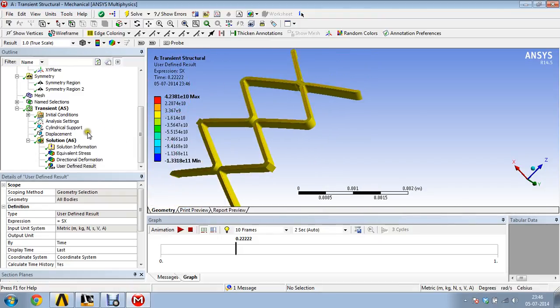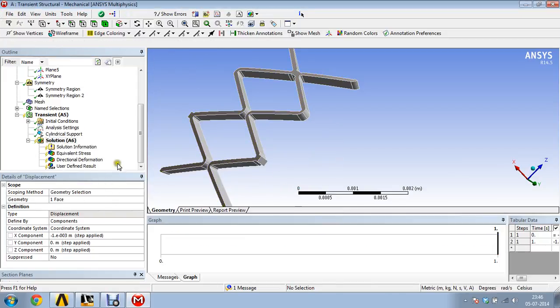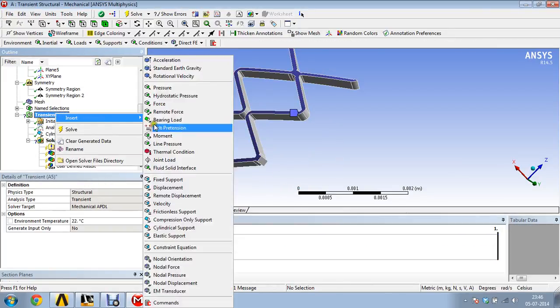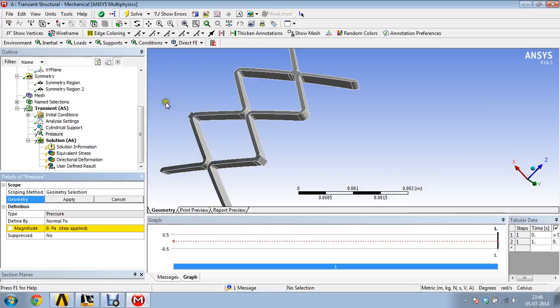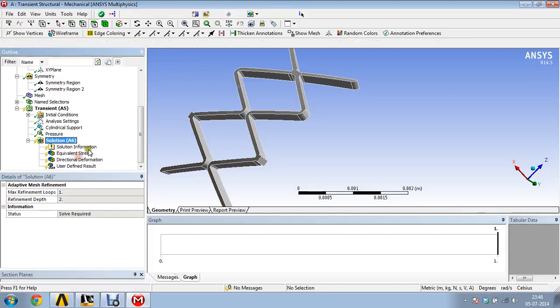And the other variation we can do is we can remove the displacement here, and what we will do is insert the pressure. Okay, so you will apply a pressure. Geometry selection, let us do geometry selection, apply pressure, and the pressure has to be applied in megapascals. So we have applied 1 megapascal of pressure, and let us see how it solves.